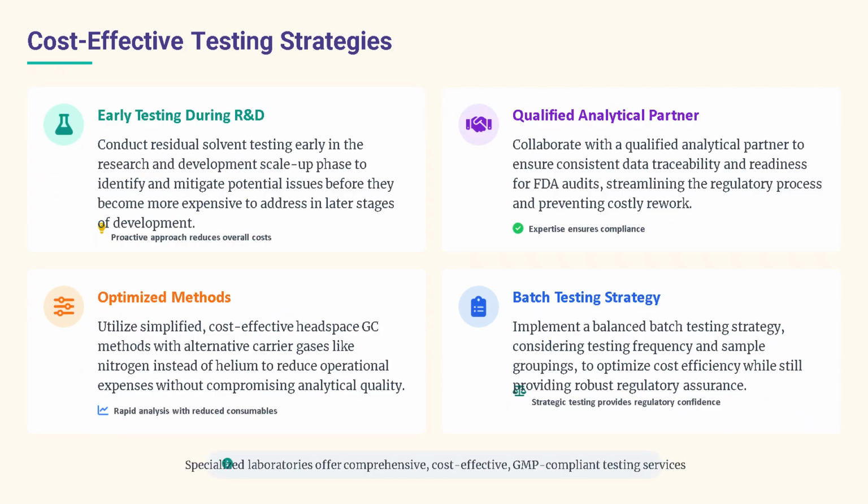At the end of the day, residual solvent testing is more than a regulatory checkbox. It's about patient safety and scientific integrity. Every peak on a GC chromatogram tells a story about how carefully a drug was made, purified, and controlled.